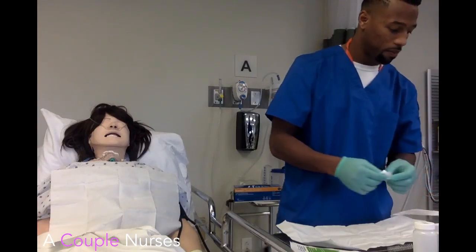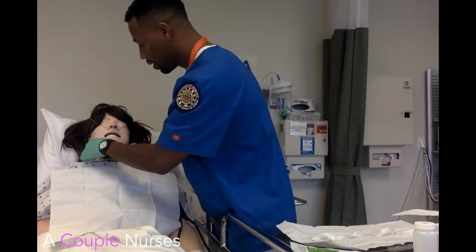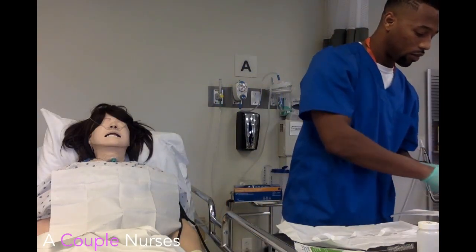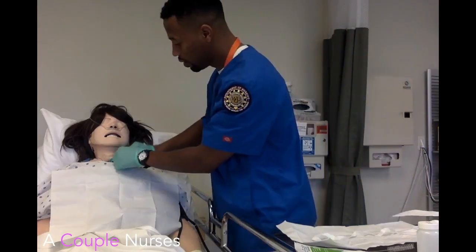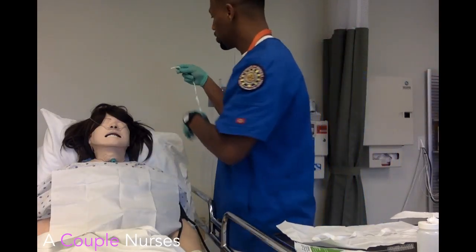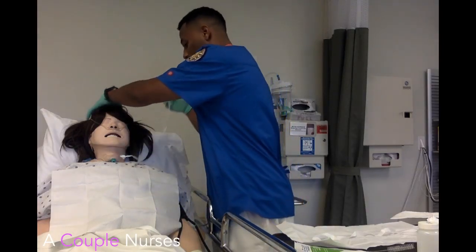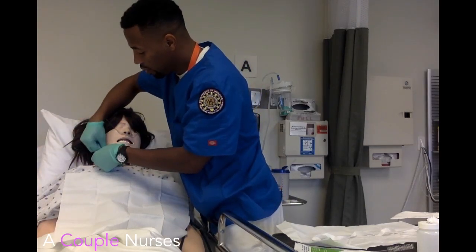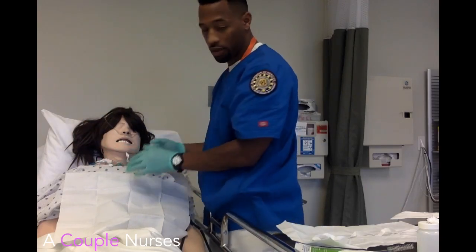We're going to get those ties changed, okay? Let me know if you're uncomfortable at any time during this. I'm going to do some care around the trach with peroxide — dry the junk out. All new ties. Almost a little uncomfortable — almost done. And of course I make sure this is more secure, but these things are pretty trash.